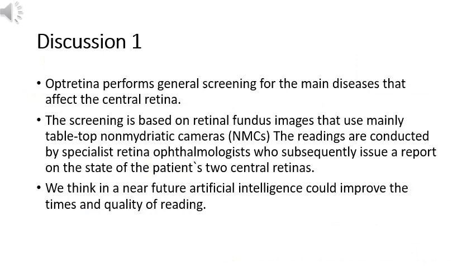For the last 3 years, artificial intelligence has been considered useful for detecting certain pathologies in retinal fundus images. Studies show spectacular results for the detection of diabetic retinopathy 14,17, macular degeneration 18,26, and cases of suspected glaucoma 15,27,28. Optretina performs general screening for the main diseases that affect the central retina. The screening is based on retinal fundus images that use mainly tabletop non-mydriatic cameras, NMCs, although portable cameras and optical coherence tomography, OCT, are also used.